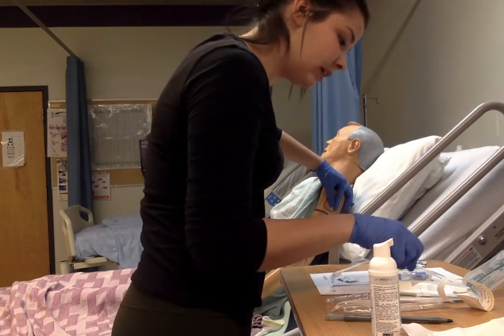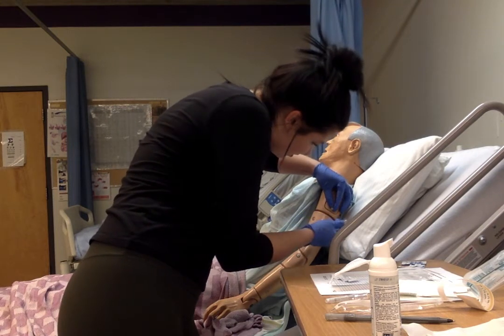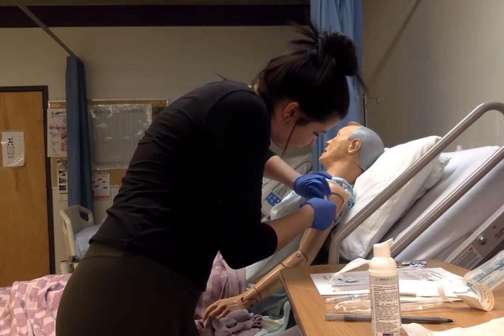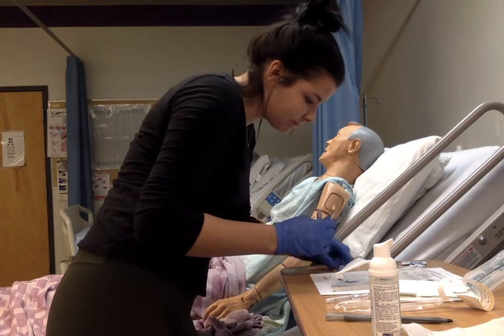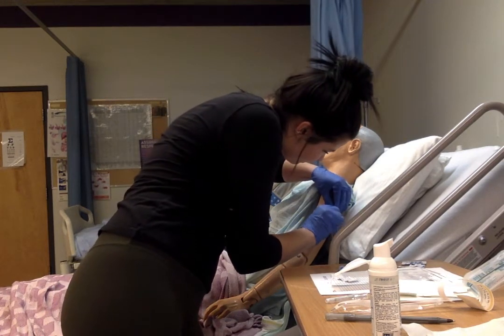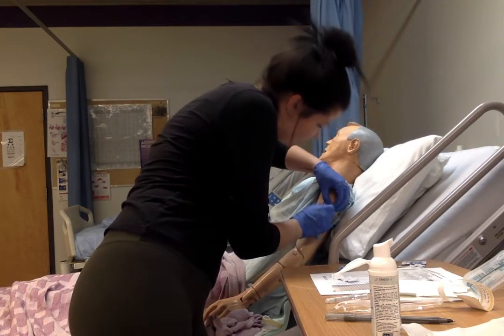All right, and now I'm going to hook up. Push that in, twist that to secure it.